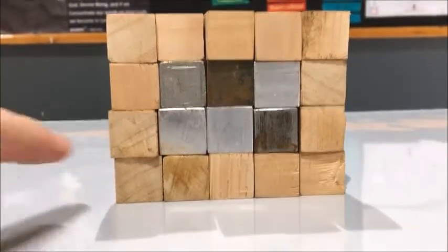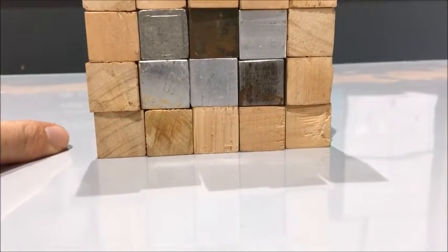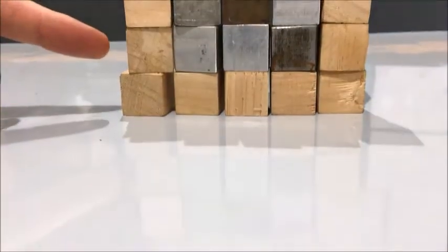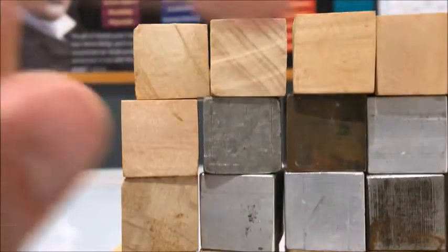And so I would expect less to be absorbed through this end, okay? Whereas the next line of voxels here pass from flesh into bone and then out of flesh again.